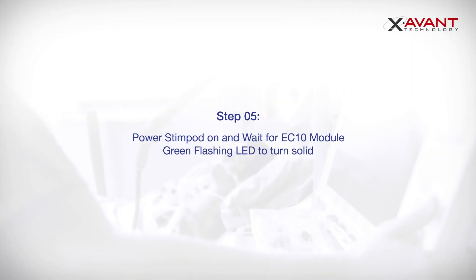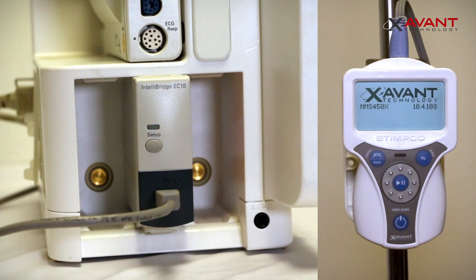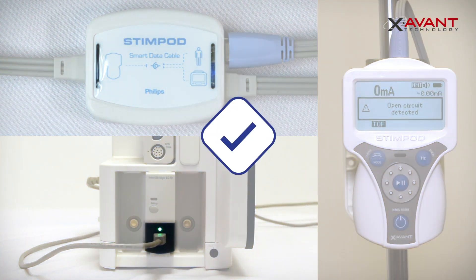Now power on your Stimpod. An Open Circuit Screen prompt will appear, and on the EC10 Module a flashing green LED will turn solid. On the Smart Data Cable Philips, both LEDs will now be blue.